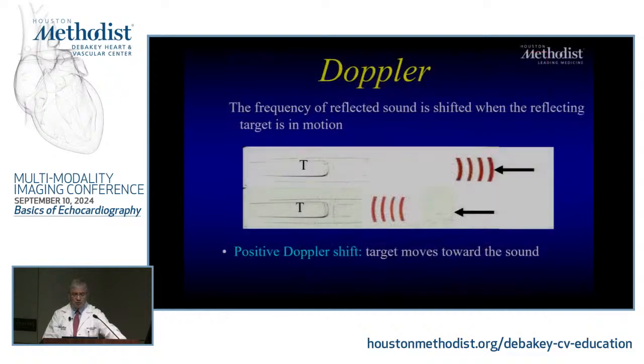So what's this principle? Okay, before going through the equation, what's this principle? The principle is, if I have an object that is emitting a certain frequency, and either I am moving in relation to something else, or something else is moving in relation to me, that frequency changes. If that object is coming towards me, it compresses those wavelengths, so it will be higher. And if it's going away from me, it will be less compressed, and the frequency will be lower.